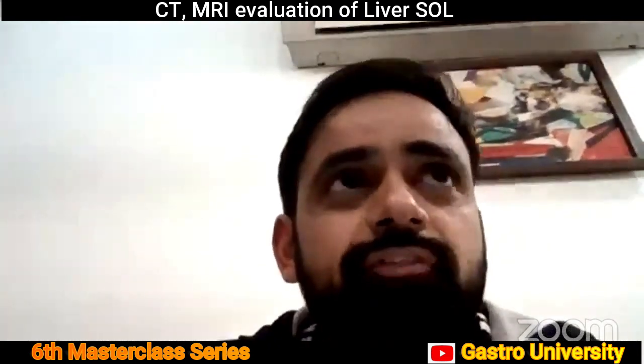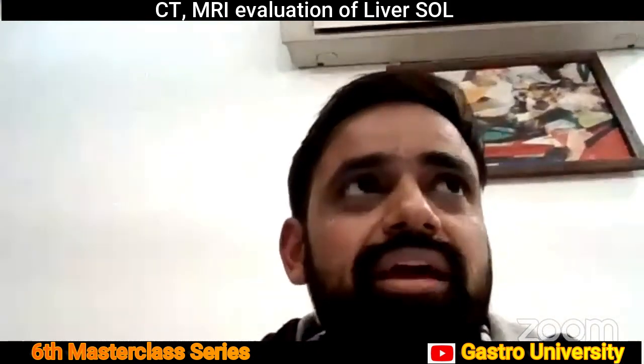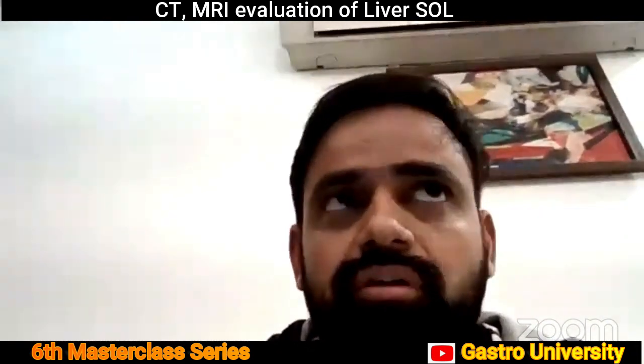Now, if the patient comes with some background CLD, if the patient has a solid lesion, whether it is a 2 centimeter lesion or a 5 centimeter lesion, solitary or multiple, definitely we require triple phase CT scan for those patients. Again, if the patient has normal background liver and a solitary, well-defined lesion, then we can have follow-up.